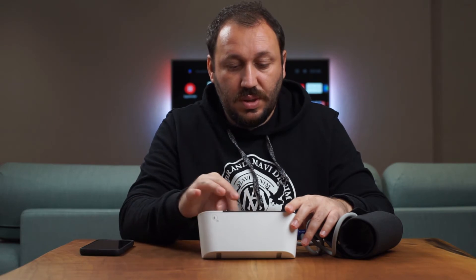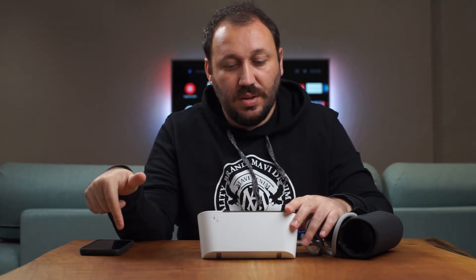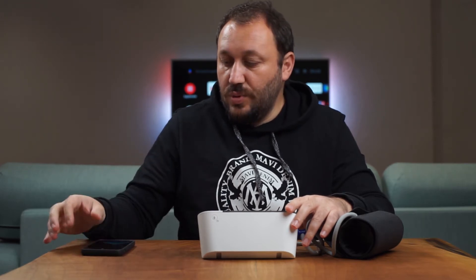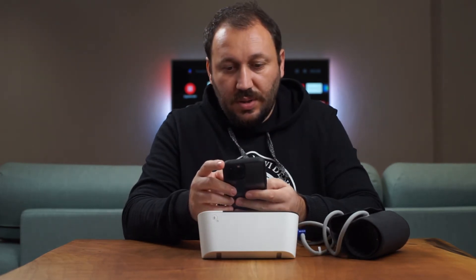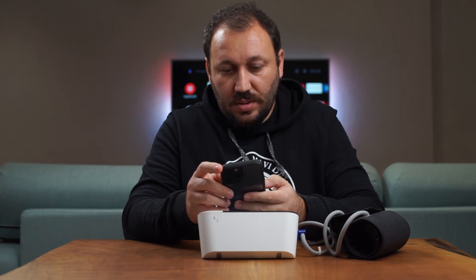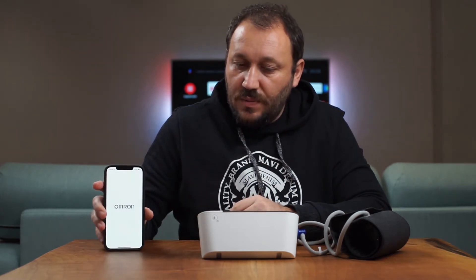A quick tip: you need to press and hold a button until you see the Bluetooth icon on the screen, then you can pair it with your phone and connect it to the Omron Connect app. I've already done this process, so let me show you how the app looks.